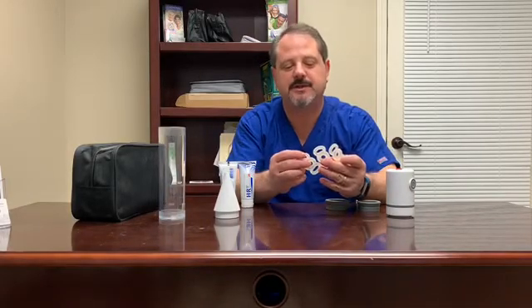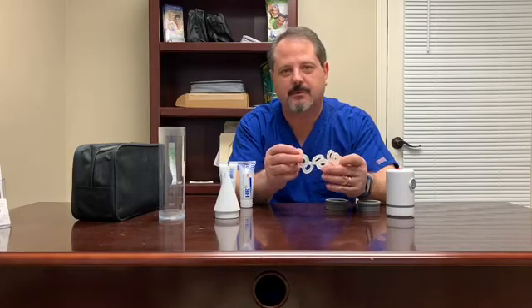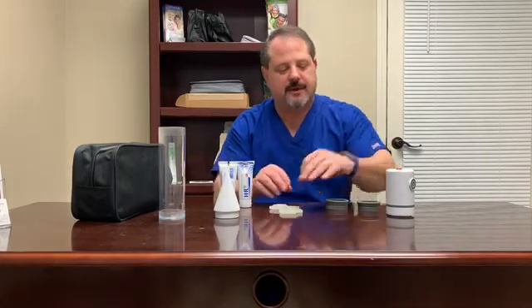You can experiment with those until you find the appropriate size. You want to use the least amount of tension required to maintain that erection, and then two sizing adapters come with it, so you can change the diameter of the end of the cylinder. If you have any questions about what comes in the kit, just please give us a call.